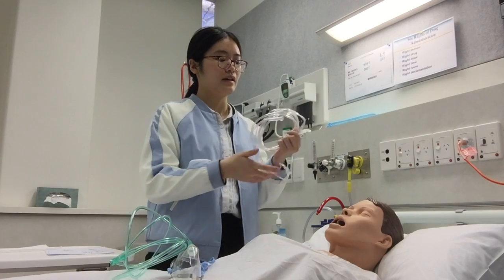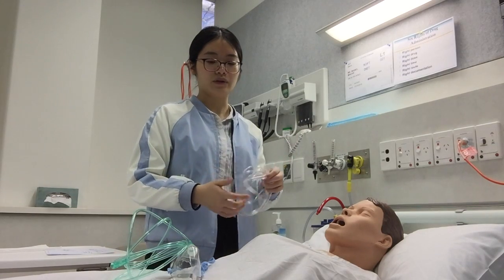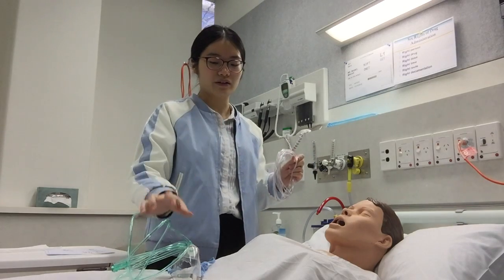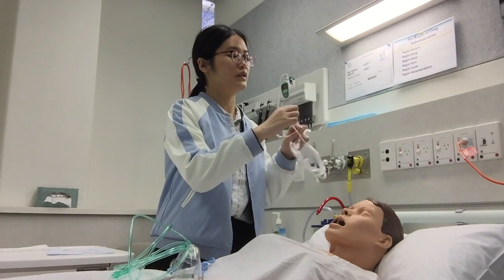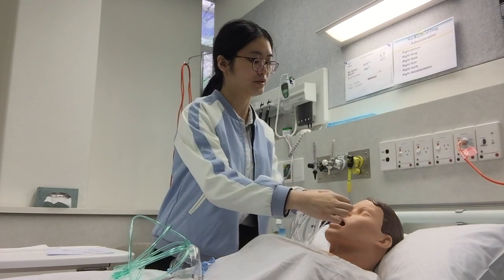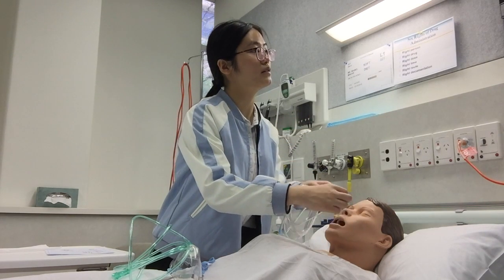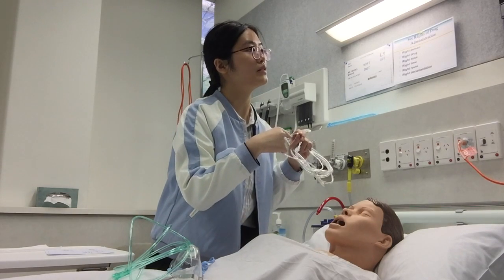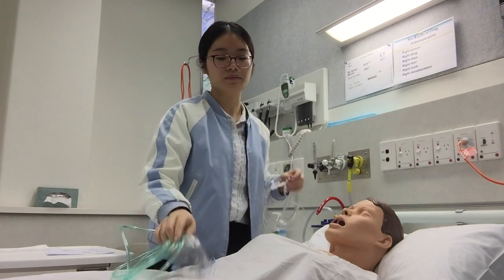Another thing I want to make sure of is the comfort level. With this one, you also need to make sure that the small tubes won't break down the mucous skin inside the patient's nose, but it's a small part, so it's better than the mask.